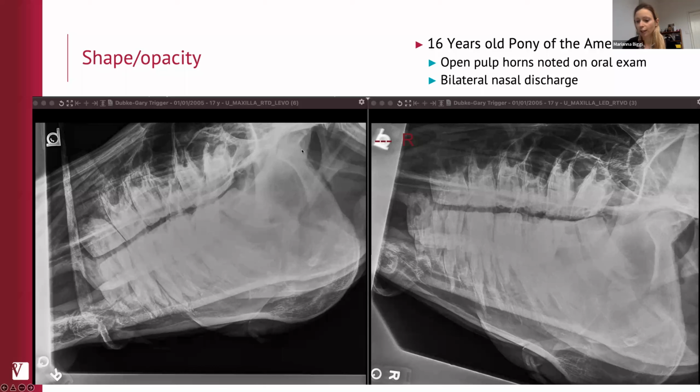Sometimes when you don't have a specific lesion, it's quite difficult to know if the view is named wrong, and perhaps only one oblique view was obtained, or actually there were two views, but then the labeling is wrong. So pay attention to the labeling of your views, so that if your images are looked at by someone else or retrospectively, a few years later, you remember which view was which. In this particular case, I know that the two views were obtained because the teeth are different.